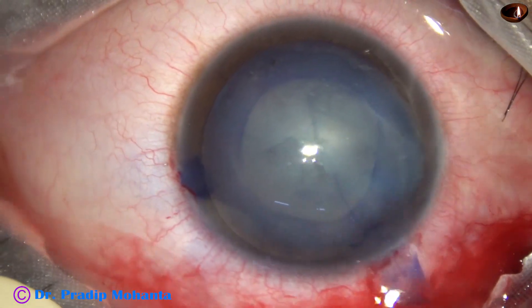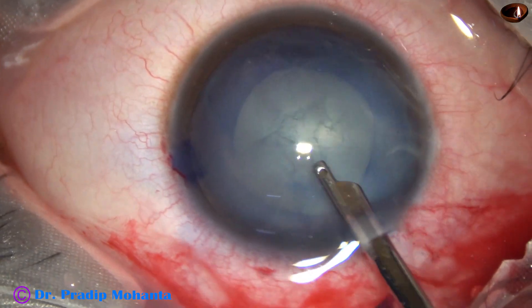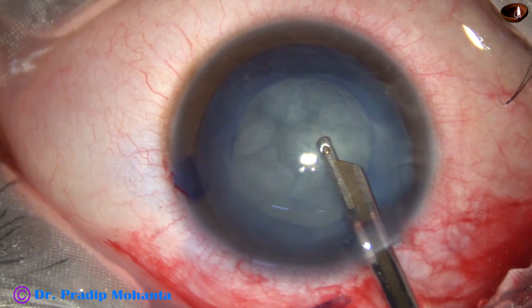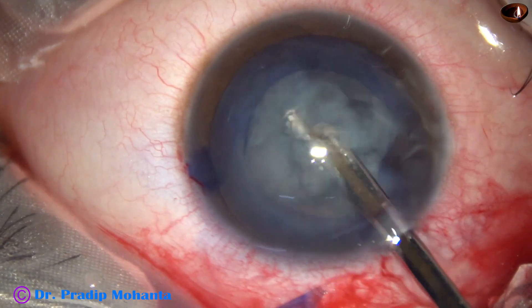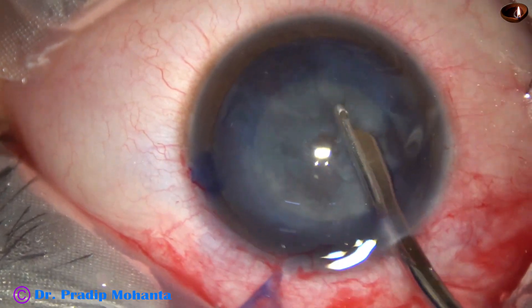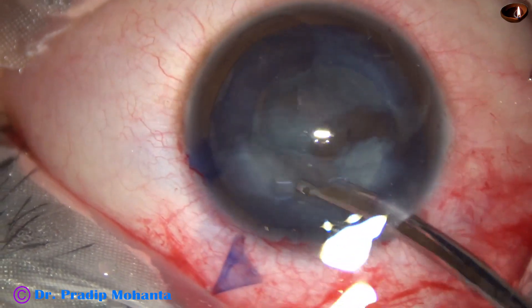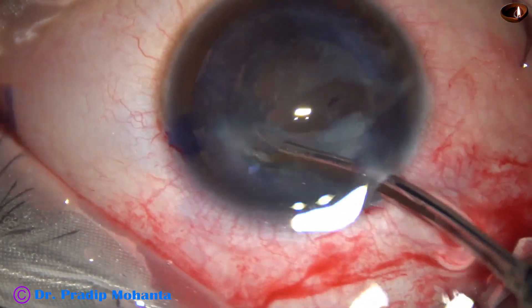Immediately, I go with the Simcoe cannula. This is a 23-gauge Simcoe, and see how easily the lens matter comes. There is no need for hydrodissection because hydrodissection has already happened — the posterior capsule is ruptured, fluid has gone into the lens mass, and all the lens matter is loose.